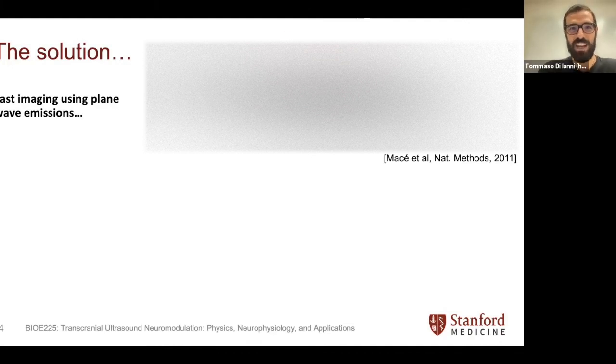So now we have this system. We're doing plane wave imaging here. Okay. So in a conventional system, what do you do? You transmit a focused beam, okay, and you receive, and what you receive basically gives you a line in your image or a couple lines, okay? Vertical lines in this case, if you have the transducer on top here. And so you're kind of transmitting focused beams and creating the image, let's say from left to right, and then you go back and you start over and you create another image. But you do it in a sequential way.